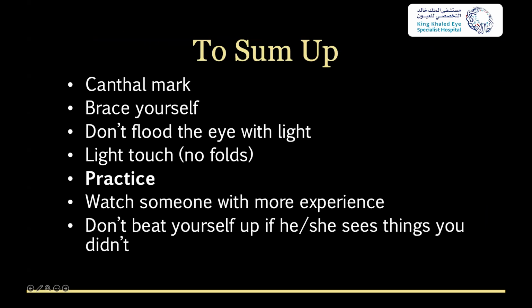And to sum up my part: canthal mark, brace yourself. Don't flood the eye with light. Use a light touch. Can't emphasize enough: practice, practice, practice. Watch somebody with more experience and don't beat yourself up if he or she sees things that you didn't.